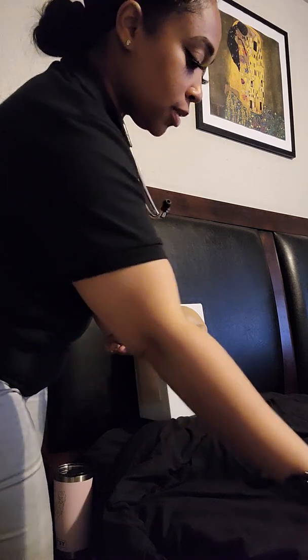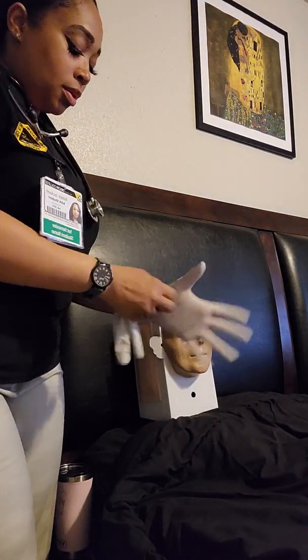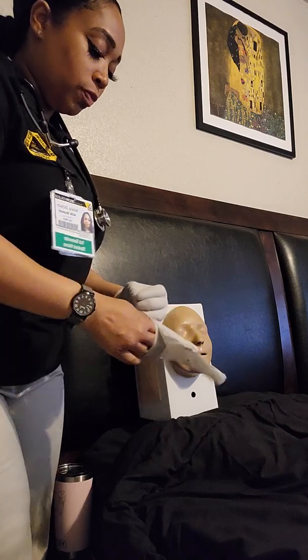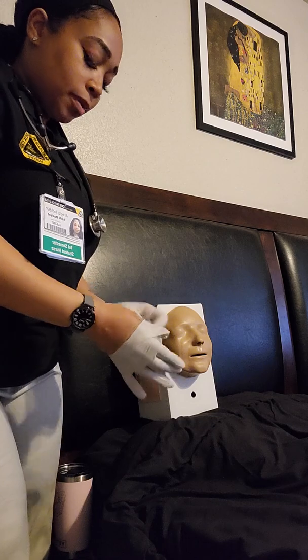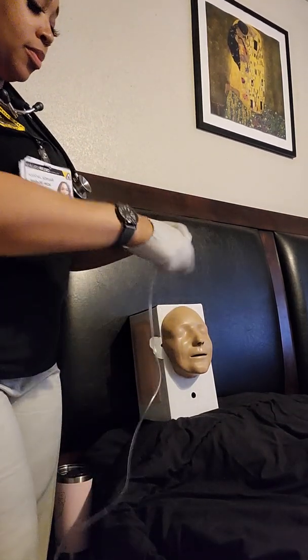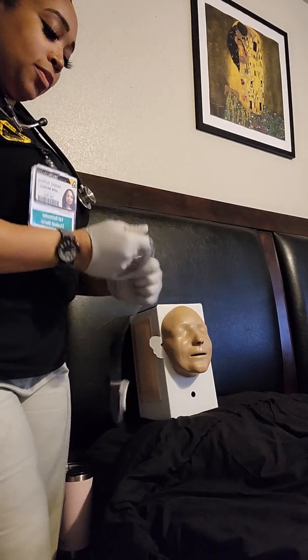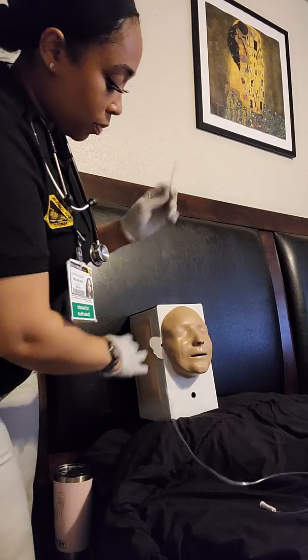So the first thing I would like to do is measure the NG2. I want to find out how deep we need to go to reach your stomach. So first, stretch it out a little bit. All right, there we go. So it can be more flexible.